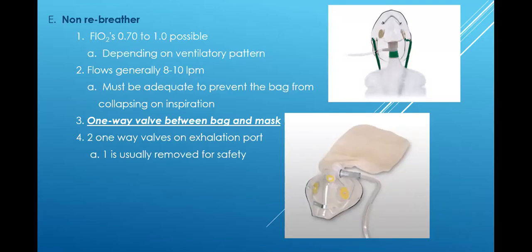But the most important difference between the non-rebreather and the partial rebreather is that the non-rebreather has a one-way valve between the bag and the mask, and two one-way valves on the exhalation ports. So here we go. This is the non-rebreather mask. It looks just like the partial rebreather, except it has a one-way valve here. See that little rubber valve? That is a one-way valve there.